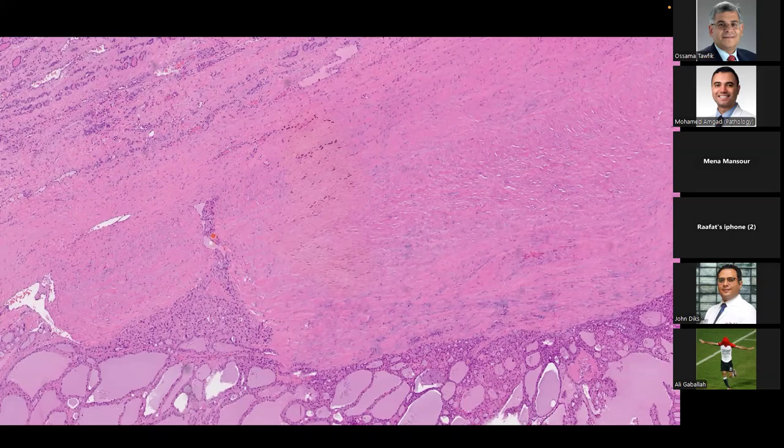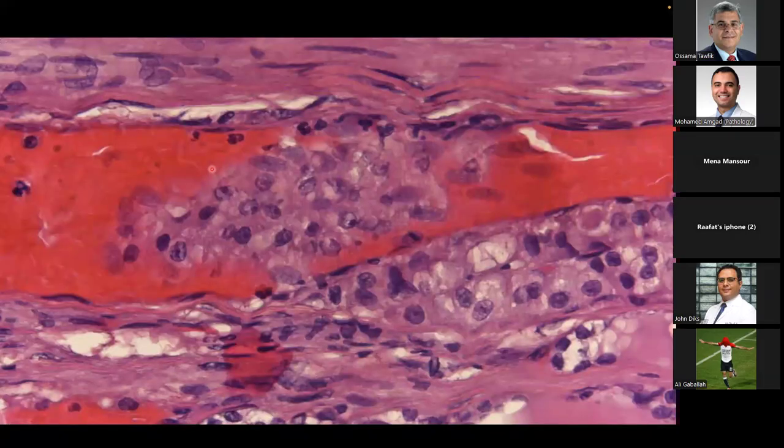You're not sure if it's going into the vascular space or not, or if it's going through. And then you have things like this, where you have a piece of follicular neoplasm that looks like it's within a vessel, but it's just floating. It's not wrapped with endothelial cells.